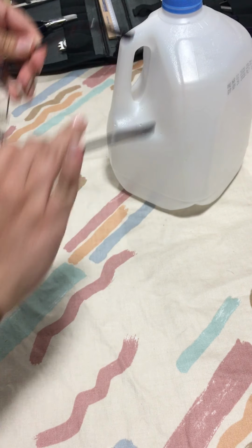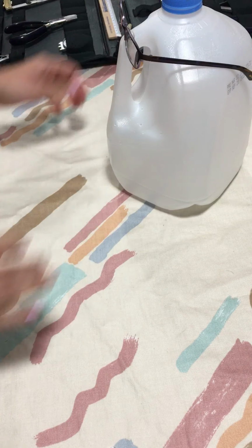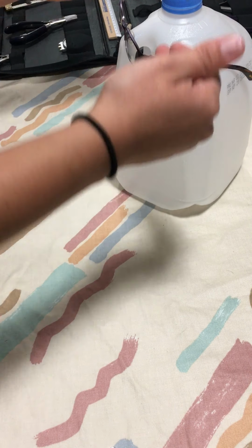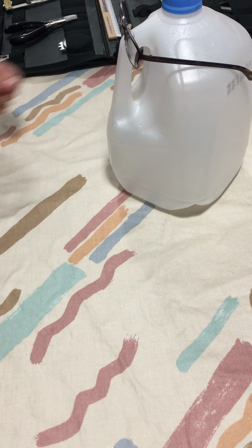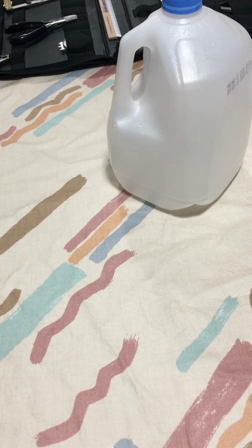Okay. So now when I put it on the patient, I could tell that I removed the retroscopic tilt. Now they're both even. Yes, now they're both even. It has a little bit of pantoscopic tilt, but that's okay. But we removed the retroscopic tilt.